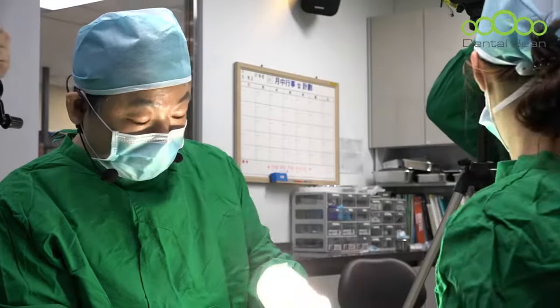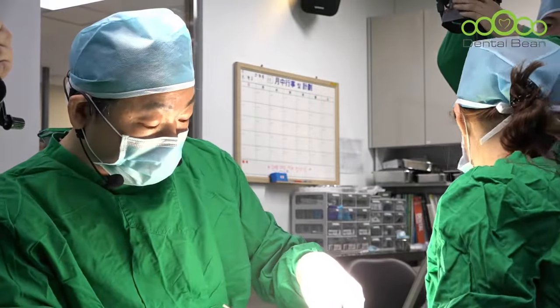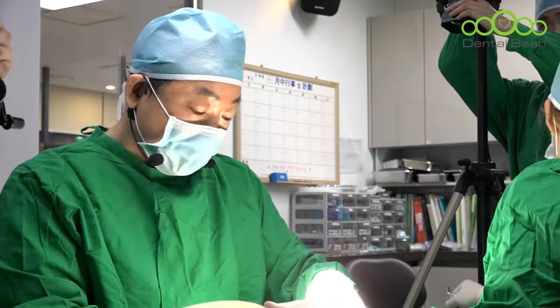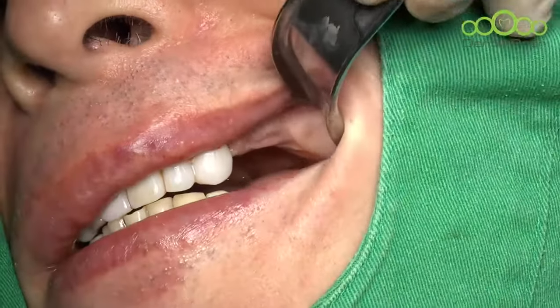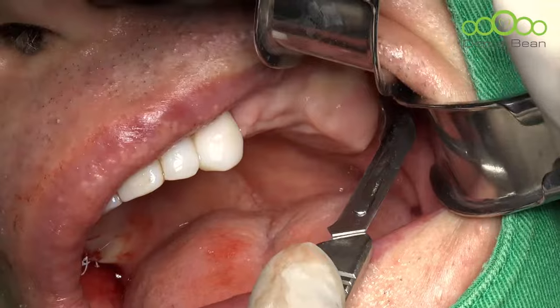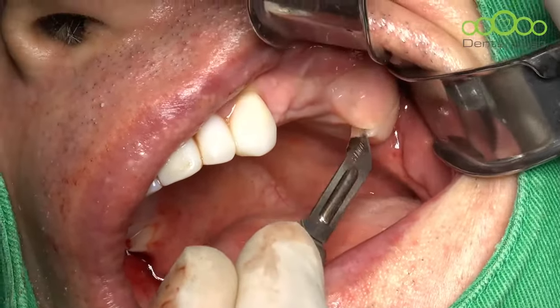I'll make the incision. When it is a lateral approach, I'll make a posterior vertical, lateral, crestal, and anterior vertical incision. Close, please. Okay, here. I can see the last tooth. Yeah, posterior vertical lateral. And move to the crest.